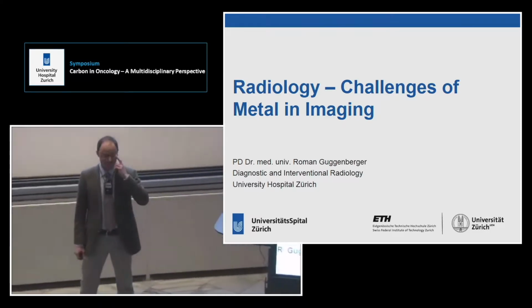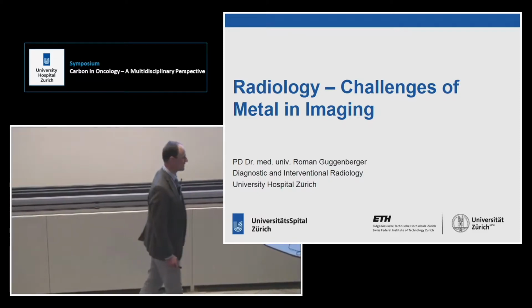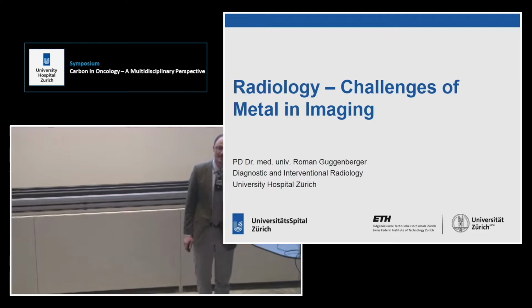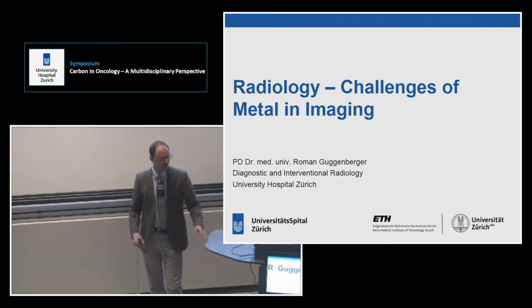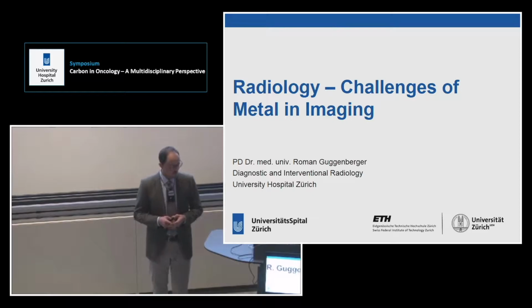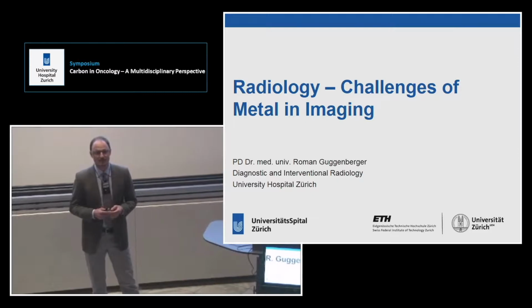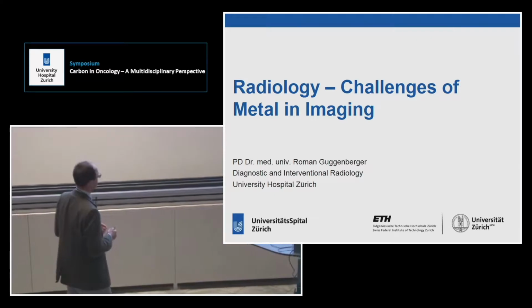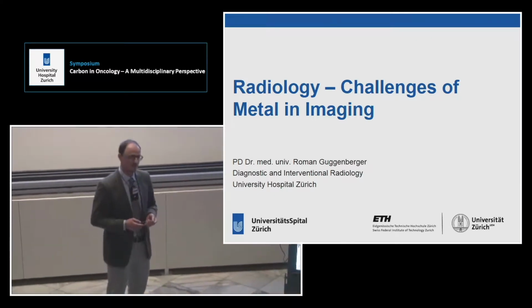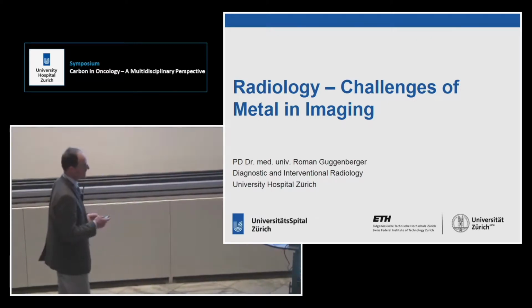Although, as you said, Matthias, this is going to be a tough afternoon for me because we're looking at ugly images from radiology, and I'm somehow the bad guy in here. But maybe taking one step back from what we've looked at now, all the possibilities with the carbon implants. Actually, the routine case in daily clinics is titanium implants. And what are those possibilities that we have right now to decrease the metal artifacts that we get from those metals? And we're going to talk about how they are caused in CT and in MR and what we can do about them, which is a pretty ambitious thing in 15 minutes.